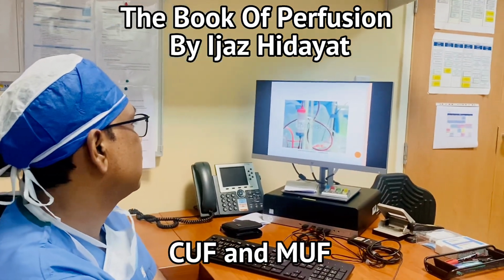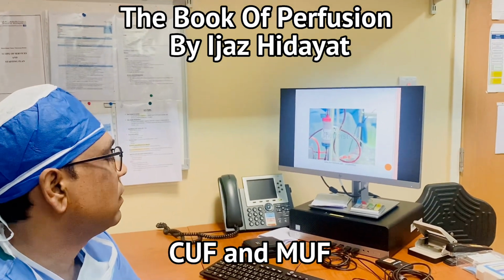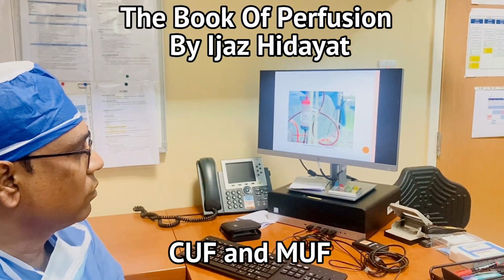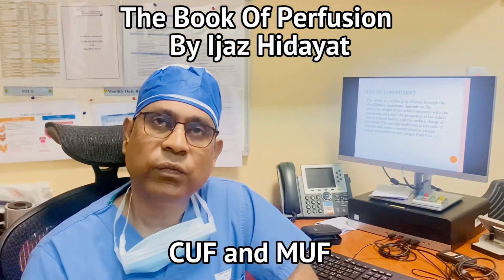So this is the hemoconcentrator. Normally we enter the blood, pass out the blood, and then we filter, we suck out the plasma water during the process of hemofiltration.